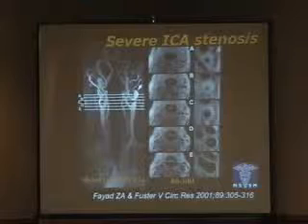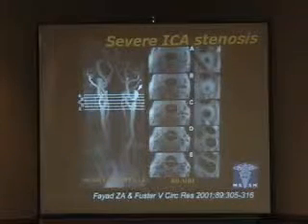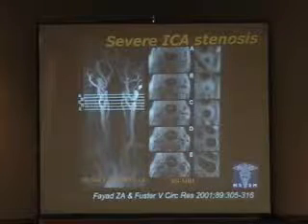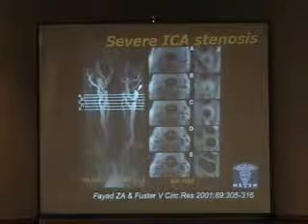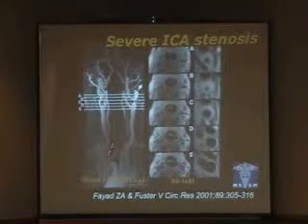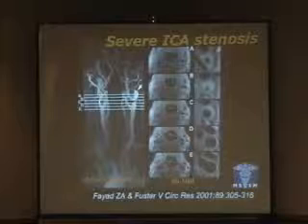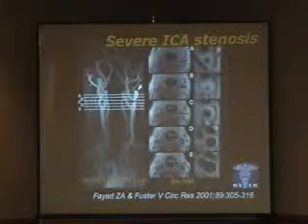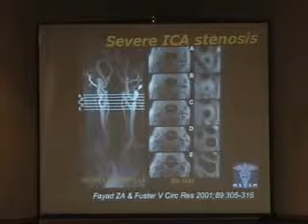What's also very important and critical is that the exam can be performed in a fast fashion, and it can also be combined with other measures of clinical importance, such as shown here, a 3D angiogram, which is performed thousands of times on a weekly basis in the United States and in the world.